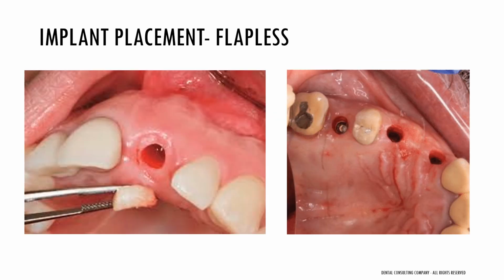Here pictured is the flapless implant placement or hole punch technique. I'm sure you all know how to place an implant or the steps involved, but if you don't, I would suggest asking a DDS or specialist in your practice to review the process, as it is helpful to be able to explain it to patients.